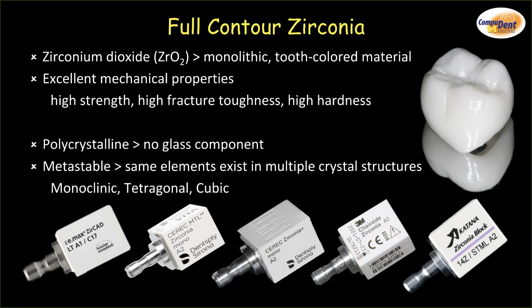Now, a couple things about zirconia. One, it has excellent physical properties. High fracture toughness, high hardness, high strength. But it has no glass, and that's important. People want to call zirconia ceramic. It's not. It's a polycrystalline material, has no glass in it. And that's important in how we handle zirconia when we go to deliver it.